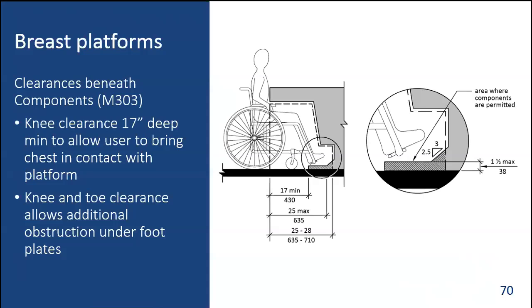Now, usually we don't allow anything to violate knee and toe clearance at all. But in this case, because of the deeper nature of the knee clearance and the data we received on footrests, it was determined that this would be permitted.